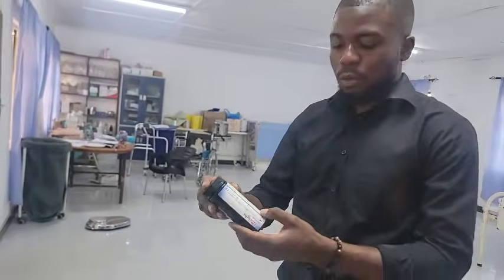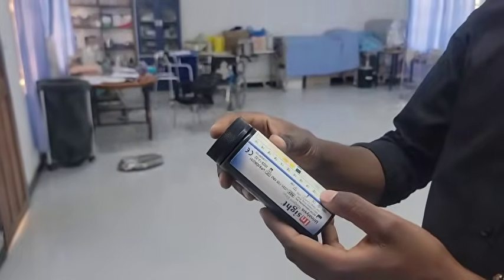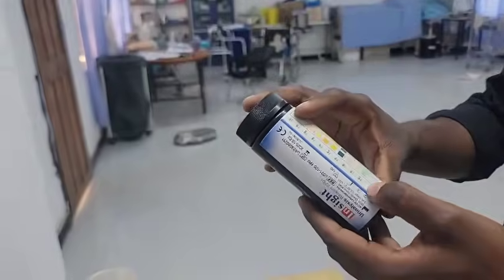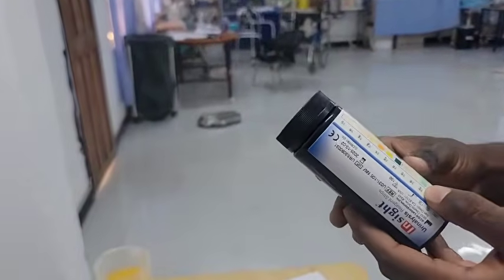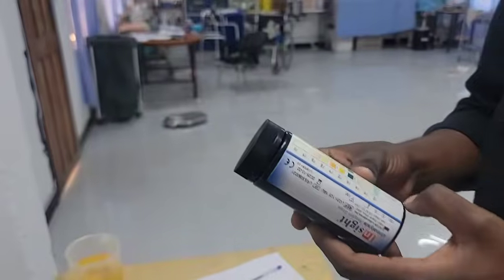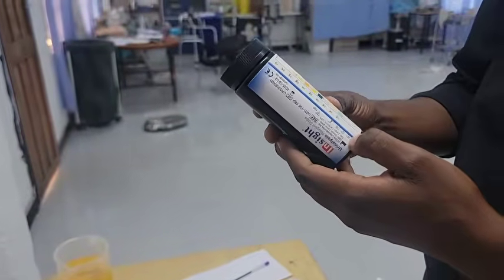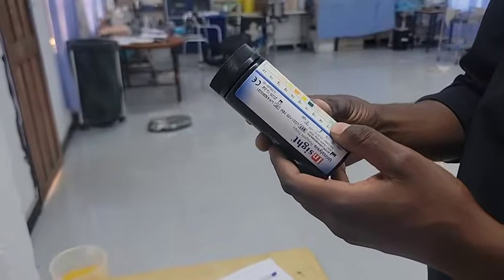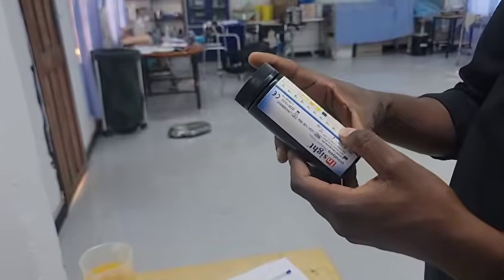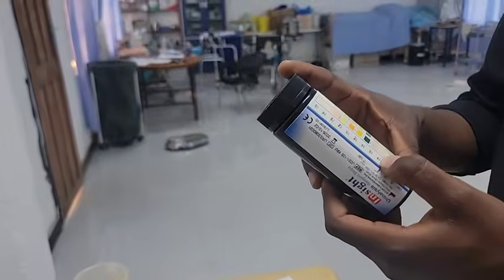Yes, so we start with the glucose. When you do urinalysis and you find that glucose comes out positive, it means that the patient has diabetes mellitus. We move to the next one. You do urinalysis and then you find that bilirubin is positive. That will simply communicate to you that the patient is having a liver condition.